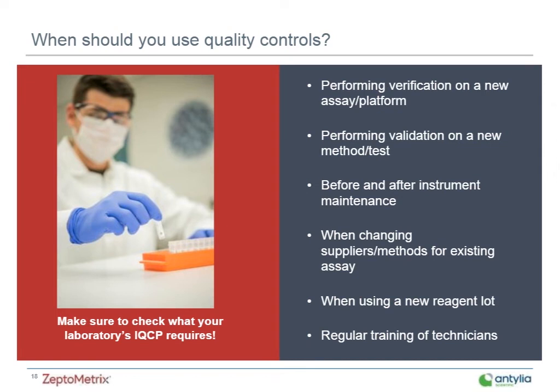Like we talked about a little bit earlier, CLIA regulations require a lab to have QC procedures in place to monitor the accuracy and the precision of the complete testing process. And they actually do describe a relatively new option that's available, which provides laboratories the opportunity to tailor what they call an individualized quality control plan, or an IQCP, for their specific testing environment and for their patients. And this option actually offers a lot of flexibility for meeting the regulatory QC requirements that are appropriate for the testing that's being performed.